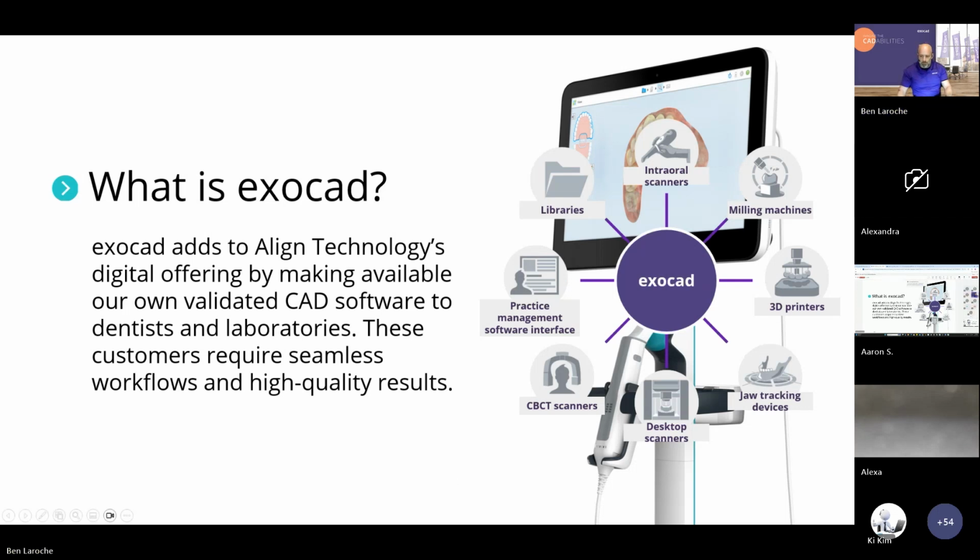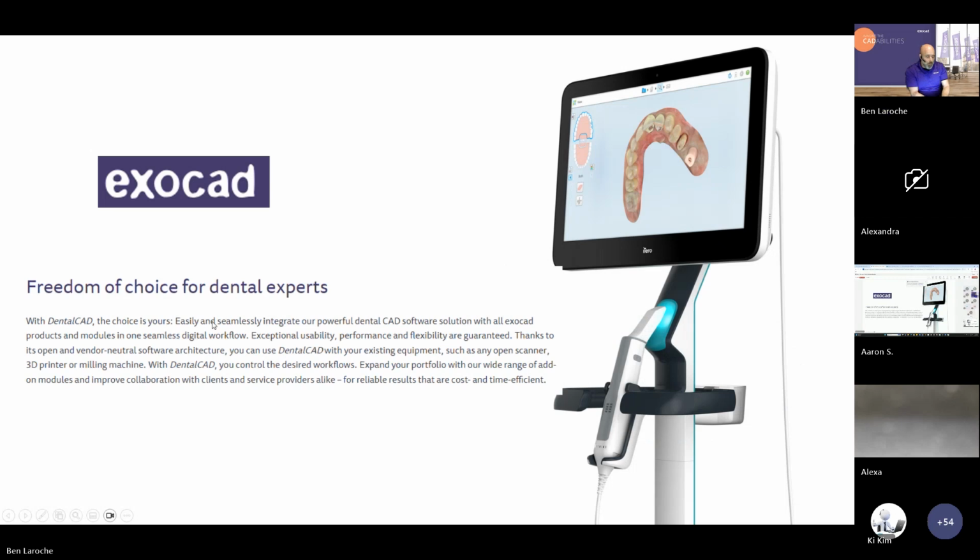With that in mind, our big advantage and the big following that we have is because we truly are hardware neutral. As exocad, our big quality is that we're not particularly linked with the hardware. We work better with the iTero scanner because it's owned by our parent company, but we also work with all the different scanners out there. As long as they want to work with us, we work with them. It's always been that way, and we're hoping to keep it that way.